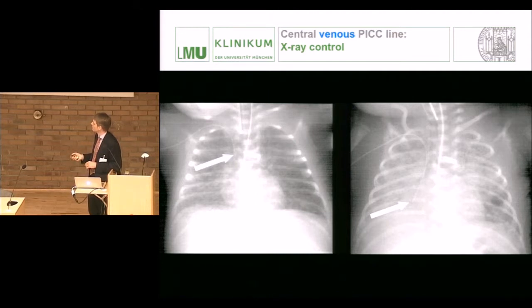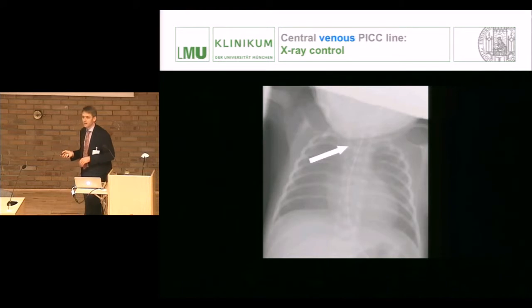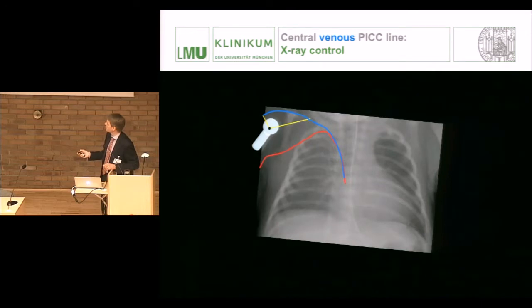And the reason why this movement is taking place, or how it takes place, very much depends on the superficial vein you're using. Because if you are introducing the PICC line over the medial brachial vein, then this PICC line will enter the thoracic cavity through a medial way. As a result, you can see now I kind of painted out the humerus here with elevated arm. If this elevated arm is brought down to the thorax, then this line will move into the superior vena cava because the line is medial to the humerus.